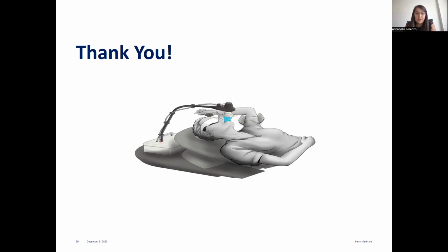Next question is, do you know if there is a reference or a source for the 25 second requirement for the breath hold? Inova currently uses 20 seconds. Do you think it's too low? What's your experience as a therapist for that?